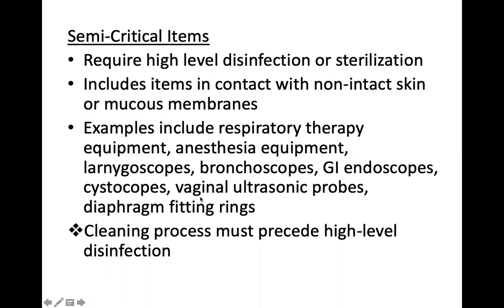chemicals. And for all of these items, because they are exposed to organic matter, if you are using high-level disinfectant chemicals, you need to clean them first. Cleaning process must precede high-level disinfection. And remember, you're cleaning with the enzymatic detergent. Okay? Your goal here is to reduce.